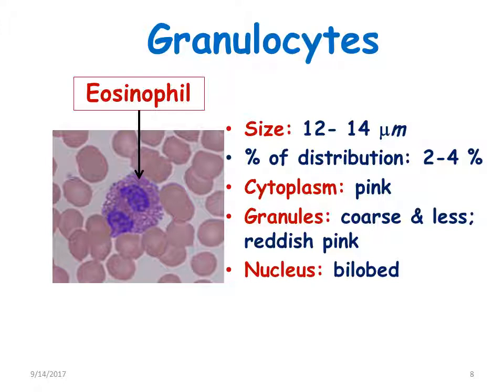Eosinophils also have almost the same size: 12 to 14 micrometers. Percentage distribution is 2 to 4%. The cytoplasm is pink in color. The granules are coarse and less numerous, picking up a reddish-pink color, and the nucleus is generally bi-lobed.